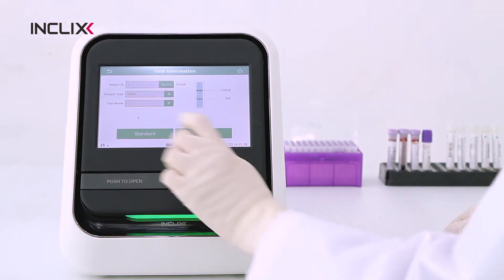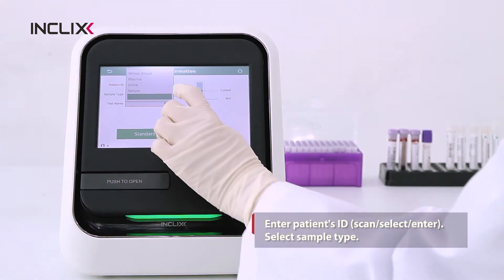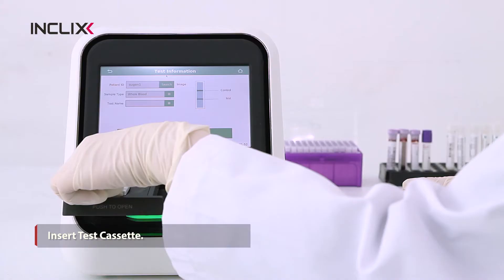Press the Test button. Scan, select, or enter a patient's ID and select the sample type. Take out the test cassette and insert it.